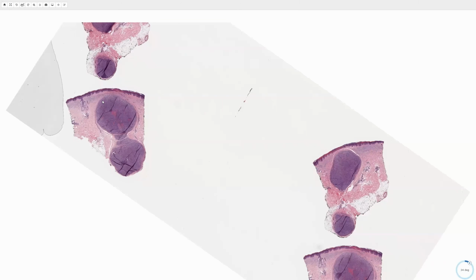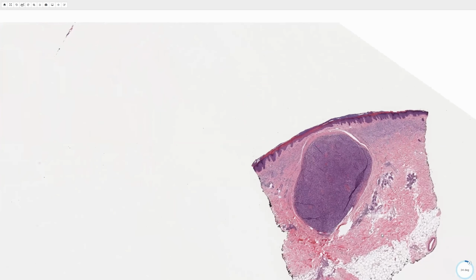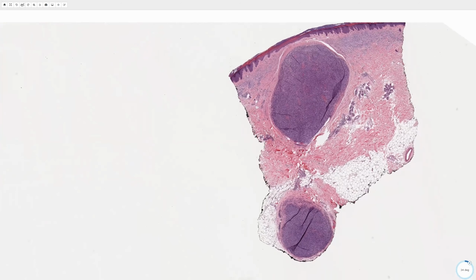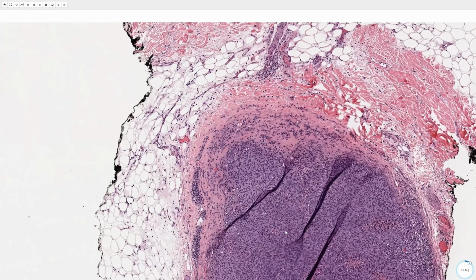Next is a relatively more common tumor that we encounter in clinical practice. And here you can see that there is a well-circumscribed nodular proliferation in both the upper and the lower dermis with no connection to the overlying epidermis. So that's one of our clues for a metastasis, something that just looks histologically out of place. And again, being situated in the lower dermis is suspicious for metastasis.